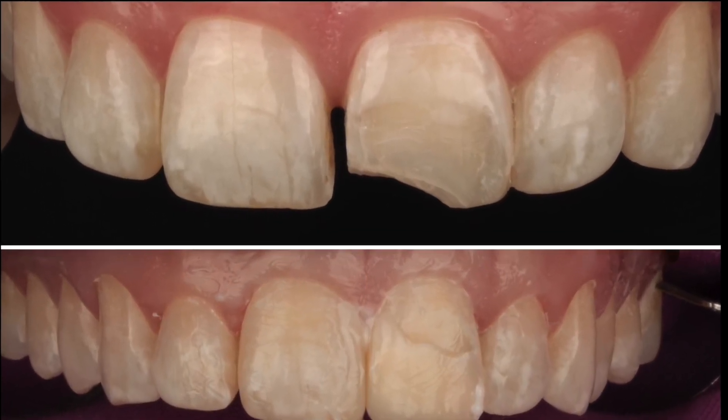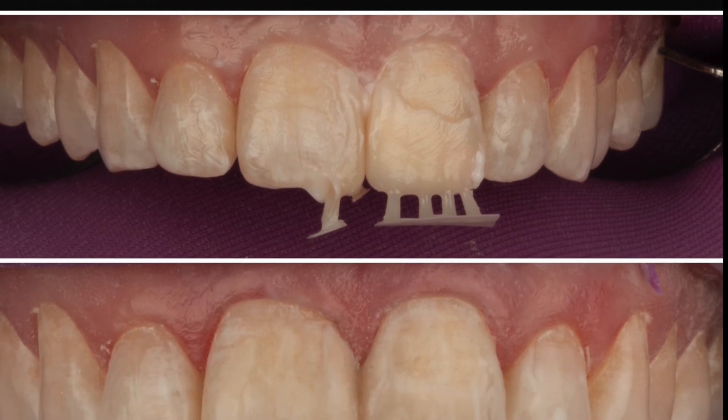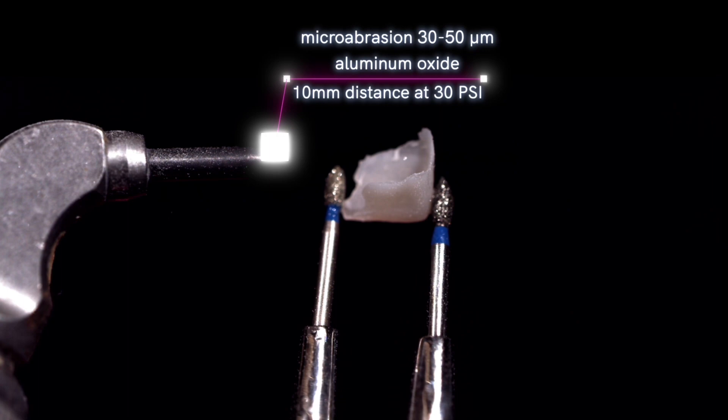Mod Institute top tip. We're going to go over how to bond 3D printed restorations. We do a lot of veneers like this — this is a case from yesterday — and we prepare it the same every time.